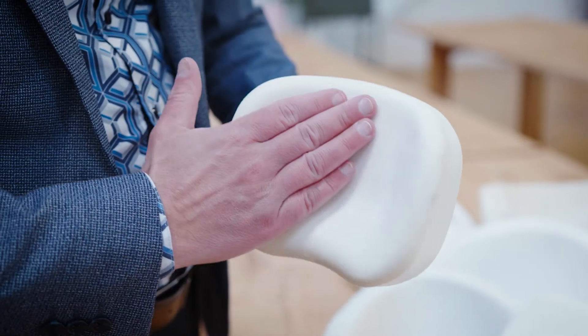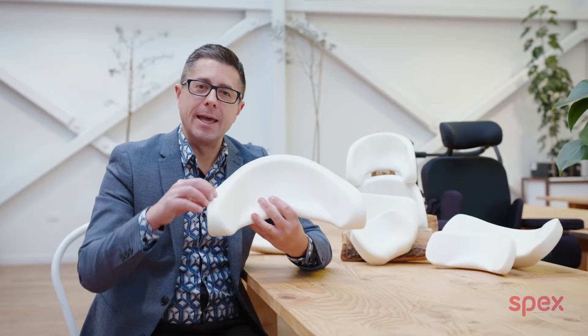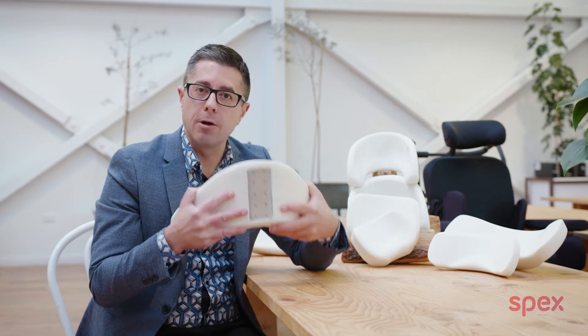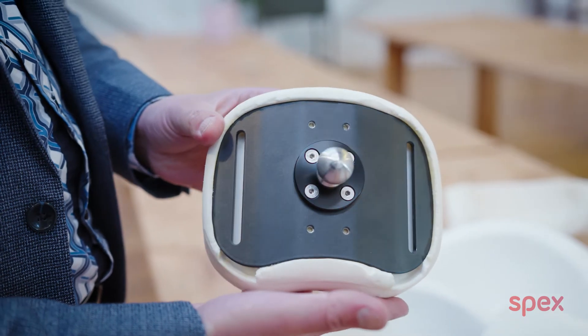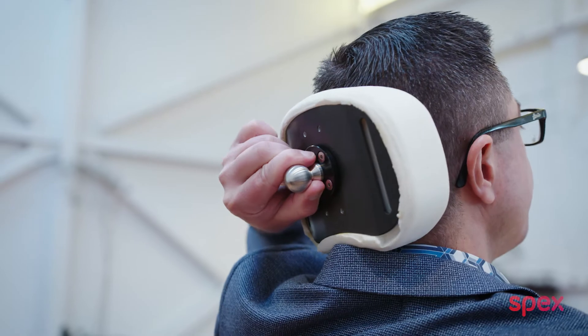We are very excited to release our new head support range from Spex. Our head support pads now have an internal aluminium shell with an injection moulded polyurethane foam covering the entire head support pad. This means that no edges are around the head support pad and it's a much more comfortable head support shape.